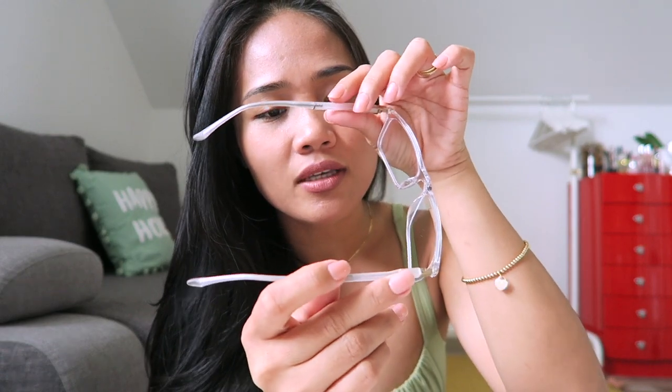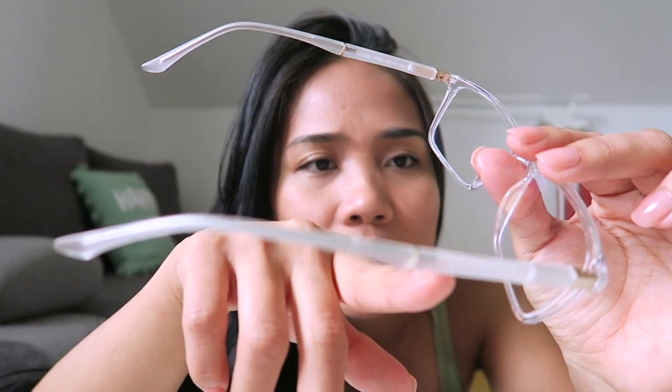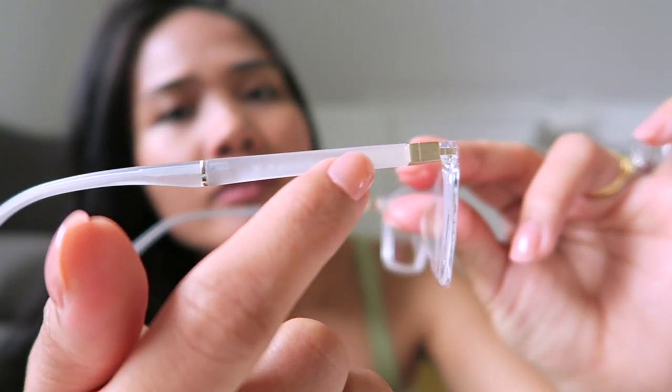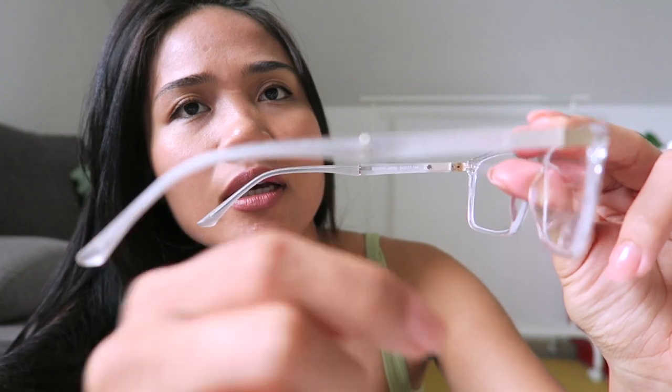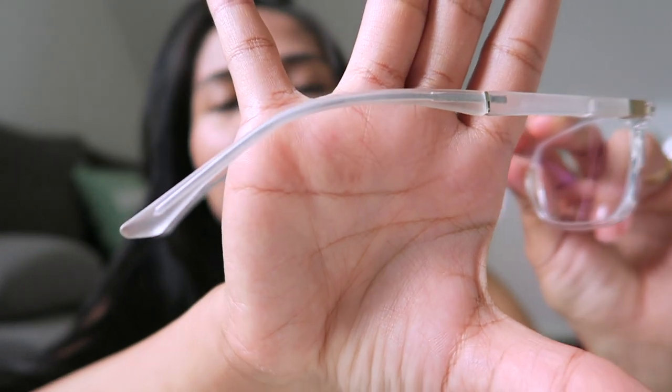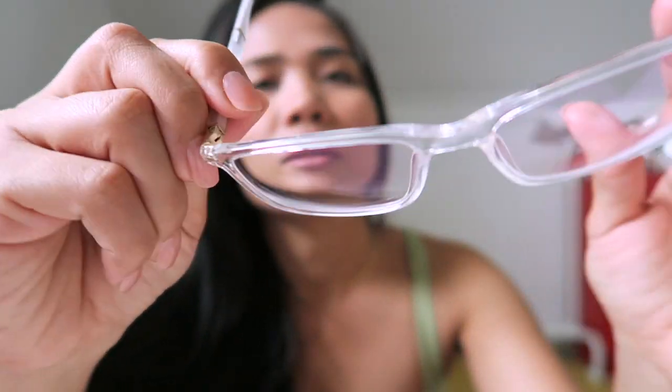It also says here 'designed in Italy' — Edison, and F05. The other side also says 'designed in Italy.' There's a gold detail here and it's just clear with gold detail. The front is all clear frames.